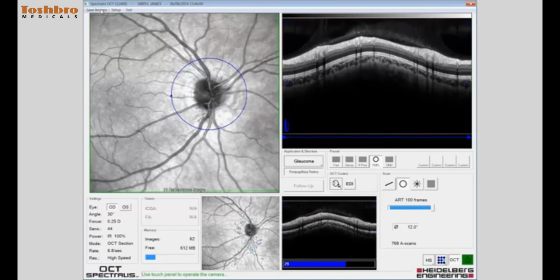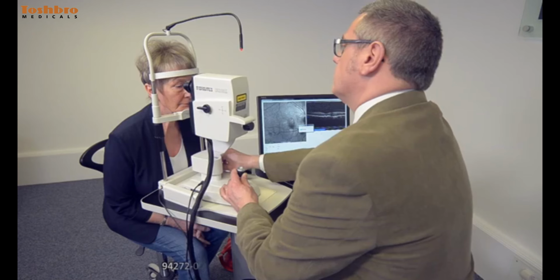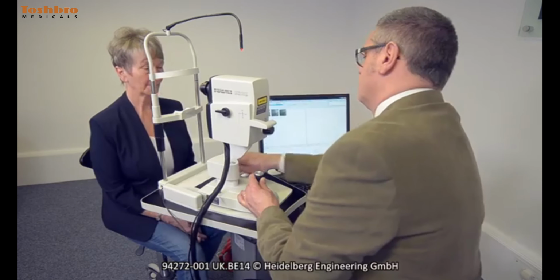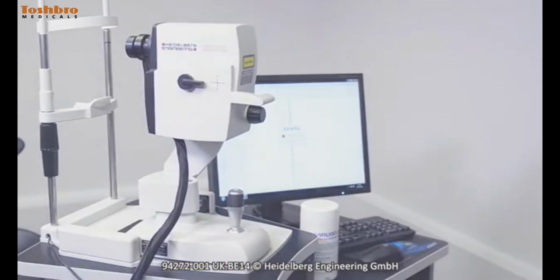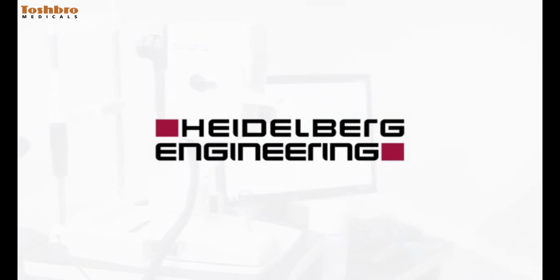The images should be saved and the patient should be instructed to relax and sit back from the instrument. The OCT scans demonstrated in this video are not intended to be exhaustive, but represent a useful starting point for anybody embarking on OCT assessment of patients.